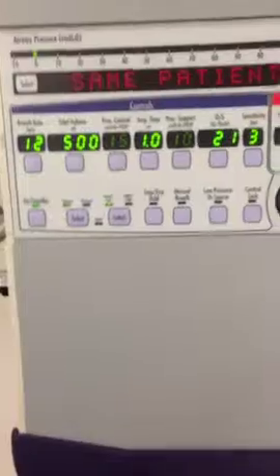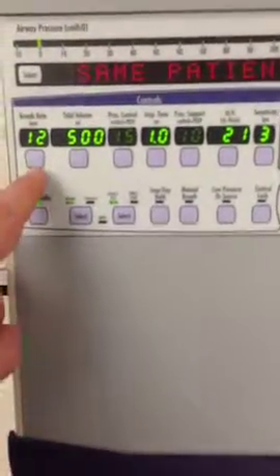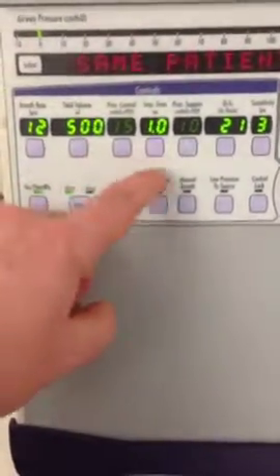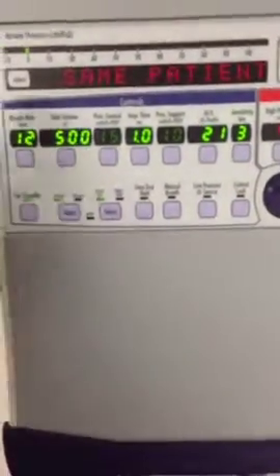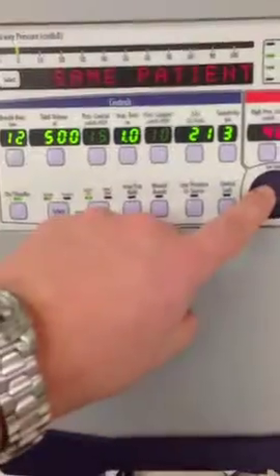This ventilation strategy was utilizing assist control, and they were volume ventilating. Okay. If I scroll out here, you can even see the set parameters. So it was a respiratory rate of 12, volume of 500, I time of 1, 21% oxygen, and trigger of 3. If I was happy with that, I would just go ahead and hit select.